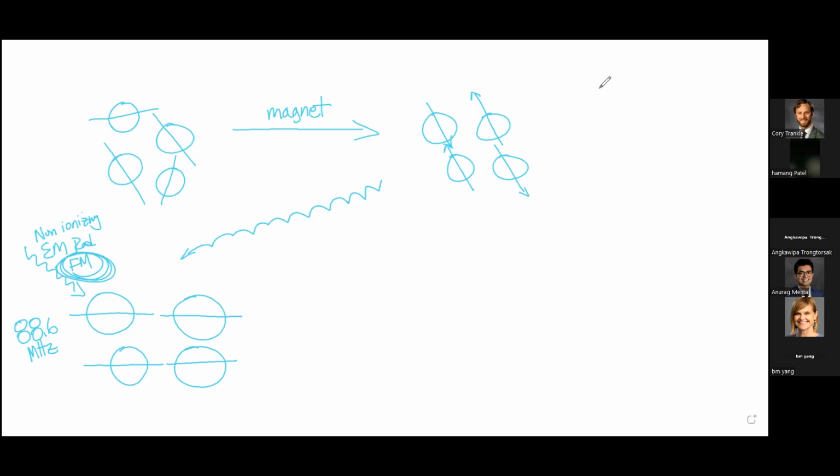Well, notice what the protons did. They tipped their spins. See up here in the top right, they were organized in one fashion, and then they tip. They all stay parallel, but they tip their spin. Now, they tip their spin in two ways.